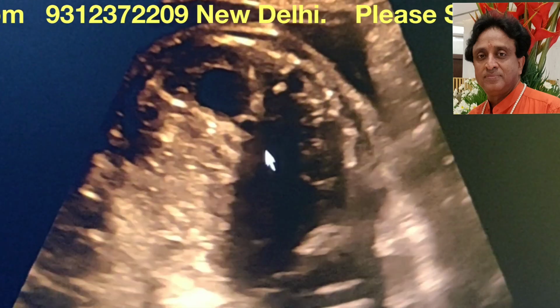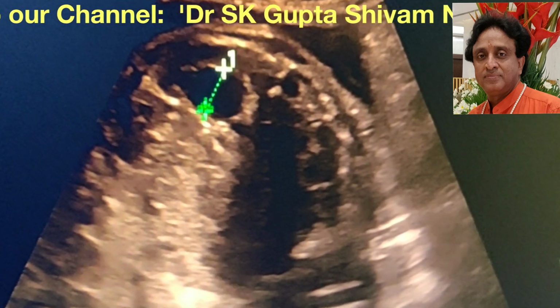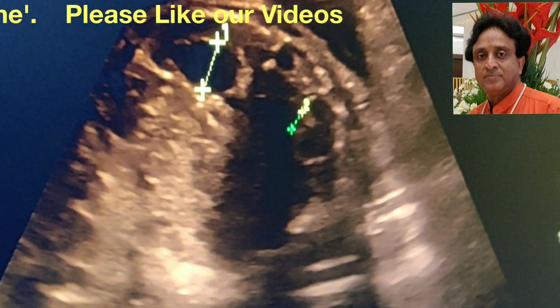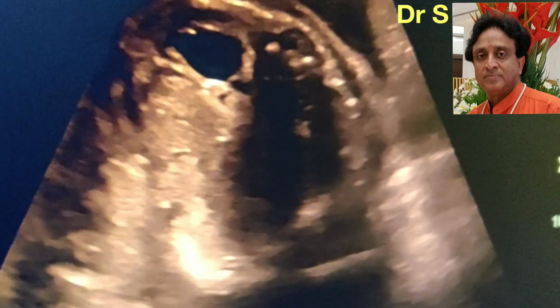This is now better seen. The kidney is better seen here. And if I freeze this section, I try to measure the AP diameter. This is the AP diameter of the kidney, and it is 14.8 on this side, and it is 6.6 on the left hand side. So there is unilateral hydronephrosis.